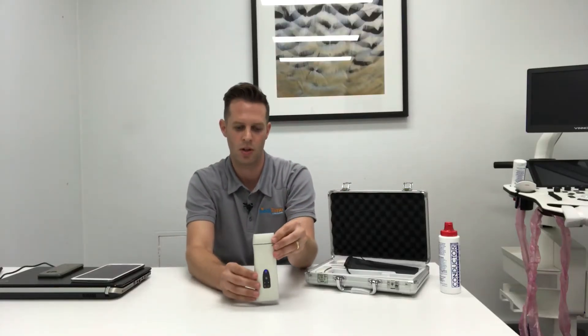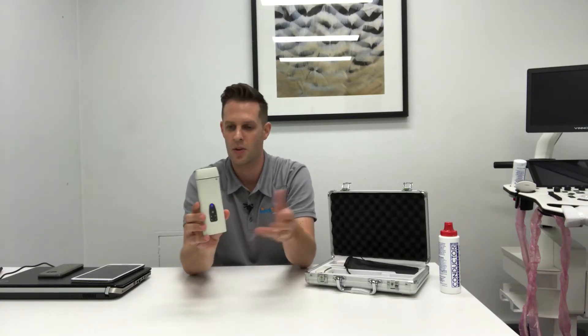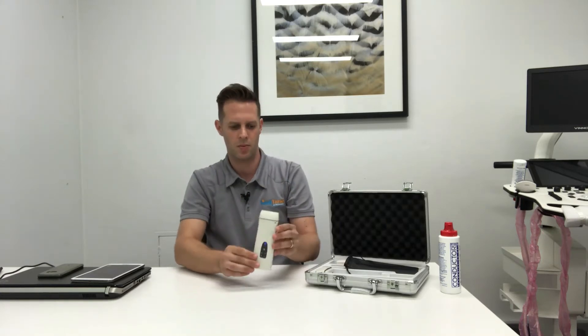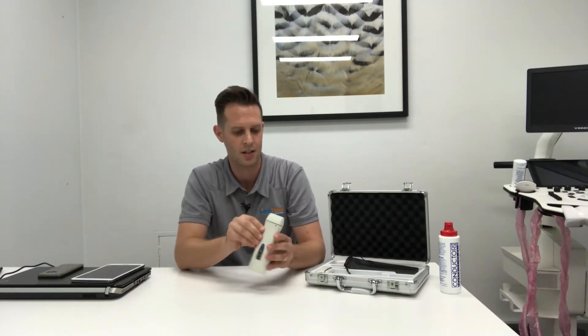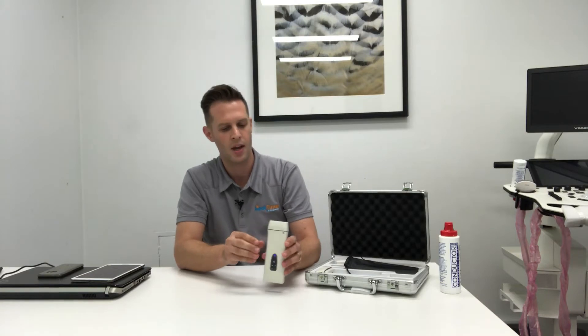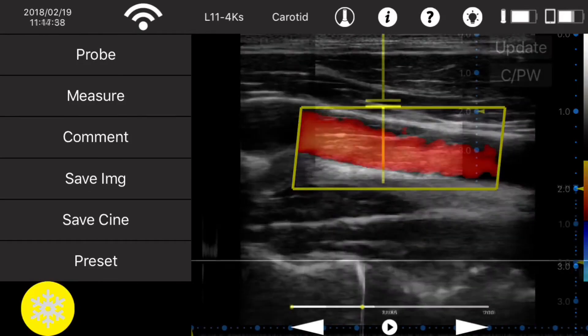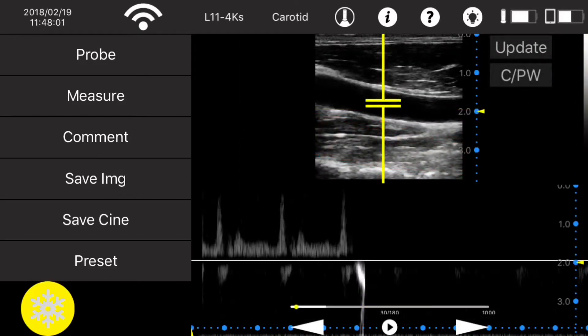In terms of the battery, QSono has done really well on this unit — they've got an eight hour battery life for one charge, which is absolutely enormous for a unit of this size. It means you can scan all day virtually without having to recharge. As opposed to some other pocket ultrasound systems that have an issue with heating up, the QSono handles continuous imaging really well, doesn't heat up, and you don't get any deterioration in image quality either.